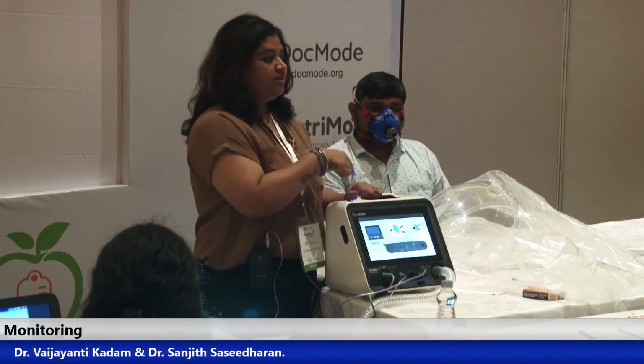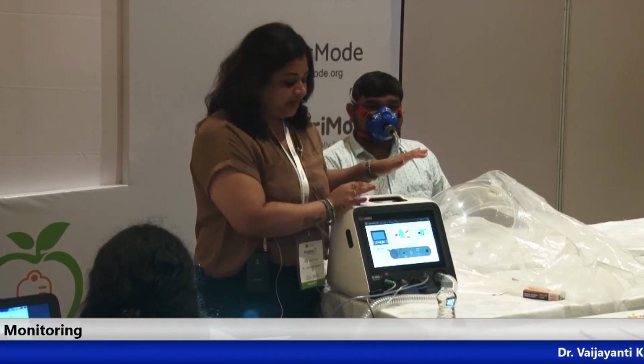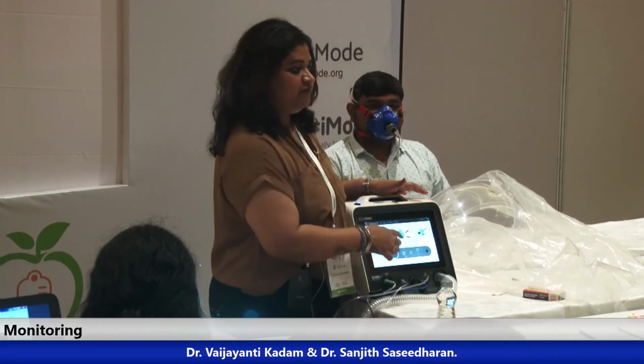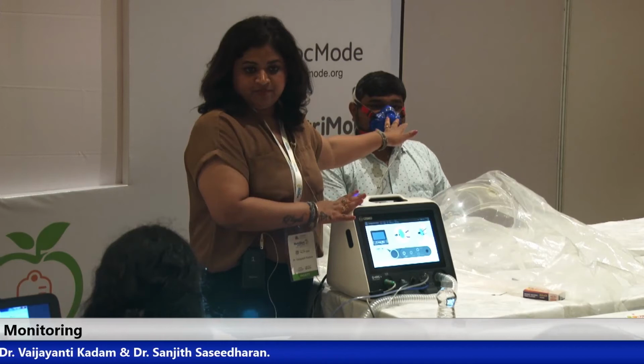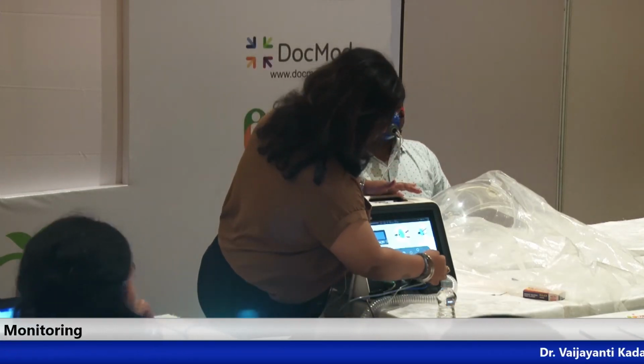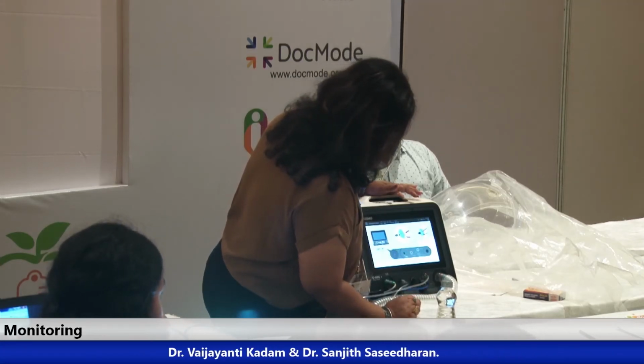All right, now what is happening? It is auto calibrating. Once it is attached, it tells me to connect the patient circuit while calibrating. We have already connected the patient. Once it gets calibrated, it will say start, then I will start. This will take some time.